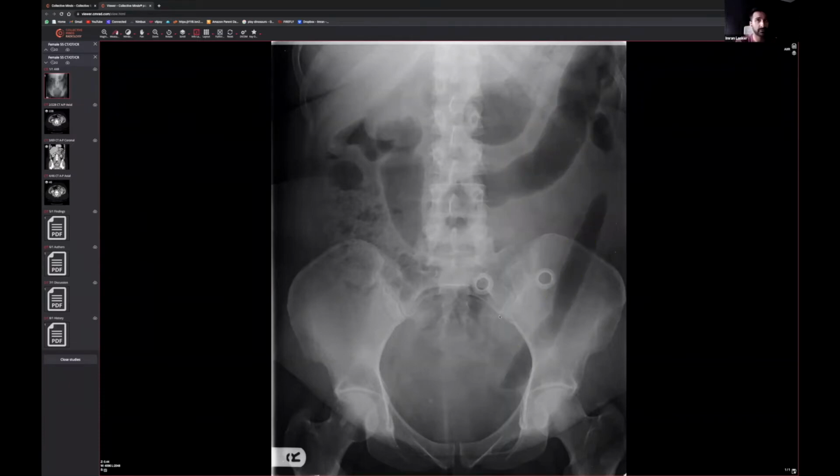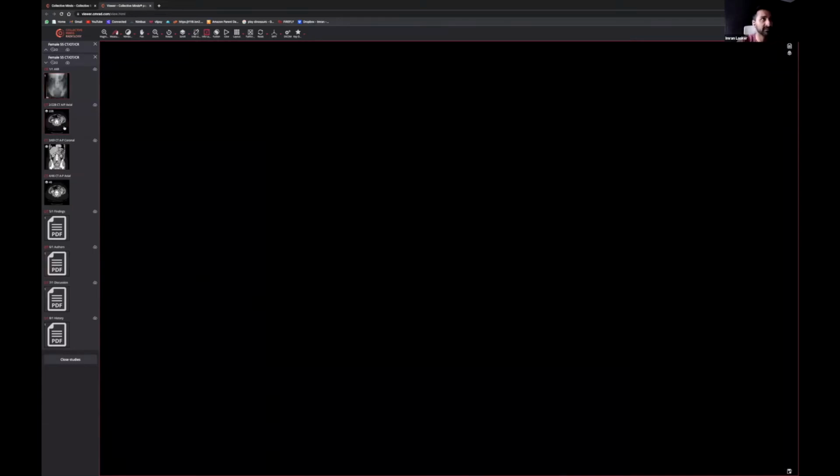These are the lines that people want to hear when you're doing the radiology exams or even your report. As soon as you say certain phrases, it means certain things. And in this particular situation, when you say featureless, lead pipe appearance to the large bowel, you're really only saying one thing. You think about inflammatory bowel disease.